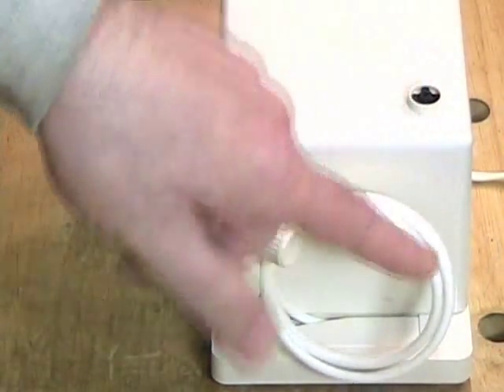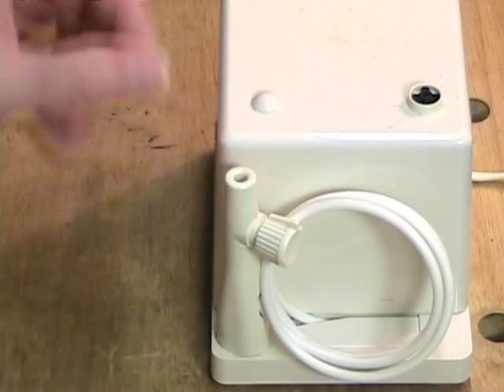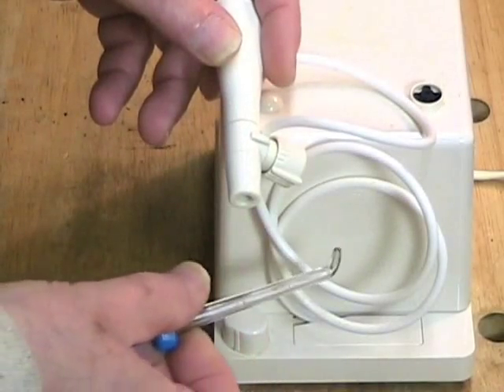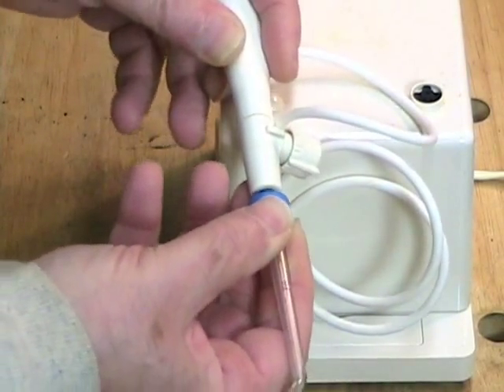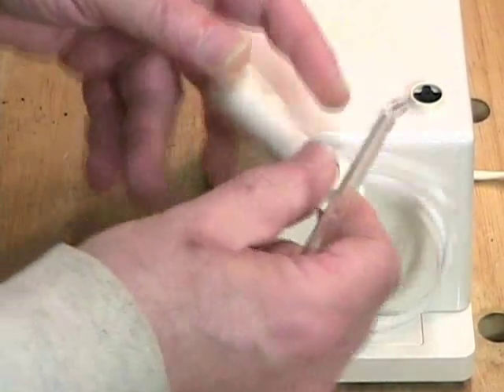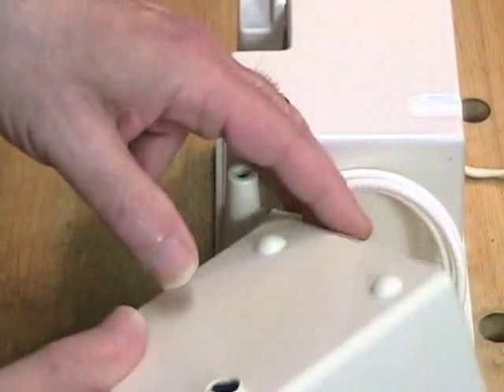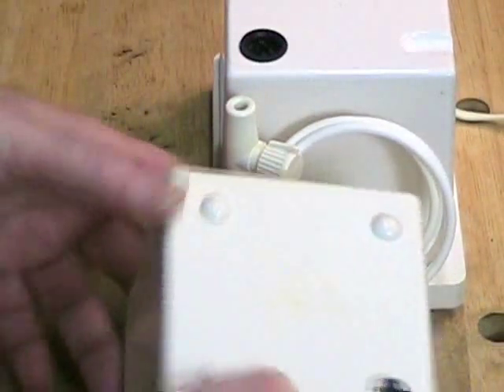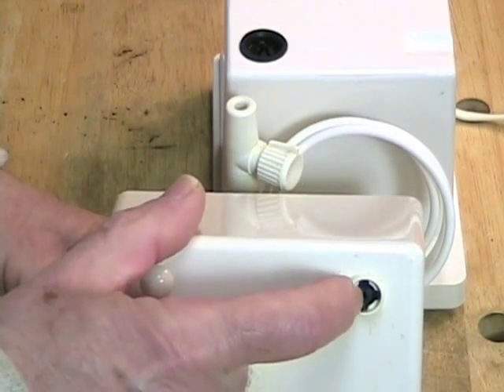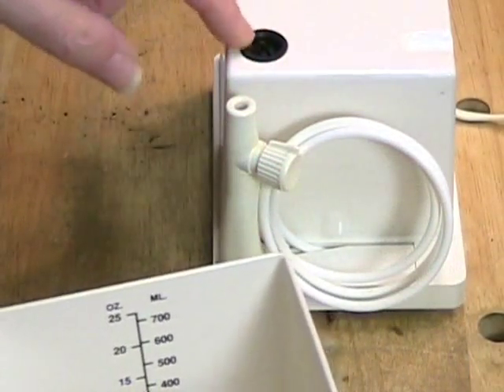Anybody who has a water pick will recognize this design. There is this rather stiff tubing here — it is stiff for a reason — and then there is this wand which comes out. As you can see, there is a special tip that plugs into the wand, and that is basically how the water gets out of the machine and into your mouth. We also have this piece here which is the water reservoir. You can see it has a little rubber bumpy here, which is a rubber valve, and that is what makes the water come out of the inside of the reservoir and into the machine.